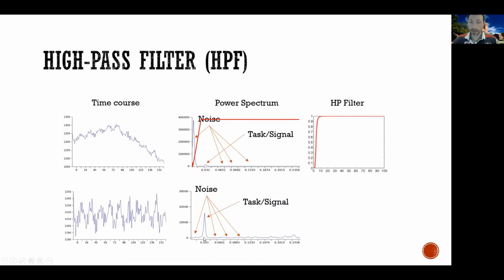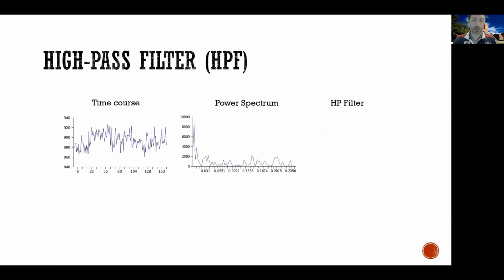But still, now the relative difference between my task and all the noise, anything that is not my task, is very favorable. So by cutting off this giant noise, I managed to increase my signal to noise ratio by a lot. Again, visually, the signal to noise ratio was very unfavorable. Here, now that I got rid of that slow frequency noise, it's much more favorable. Signal, that's the power of my signal, and this is the power of everything else. Good signal-to-noise ratio.